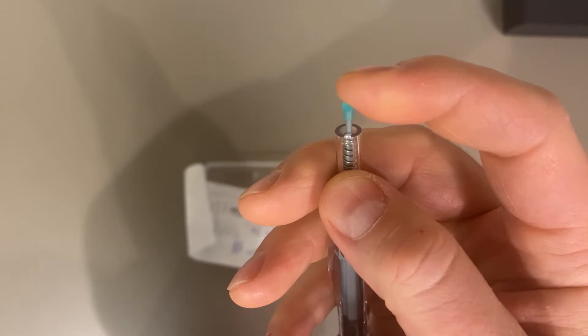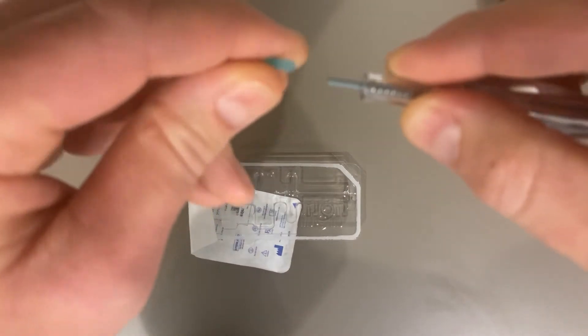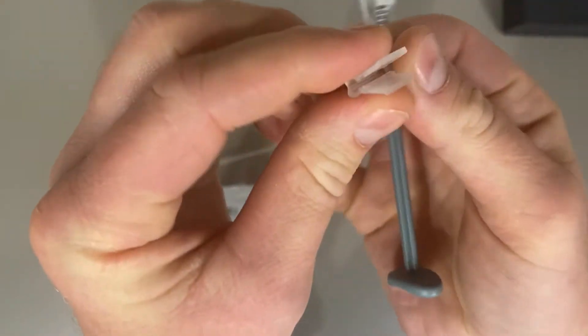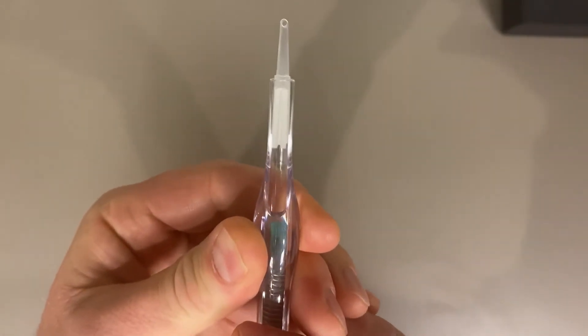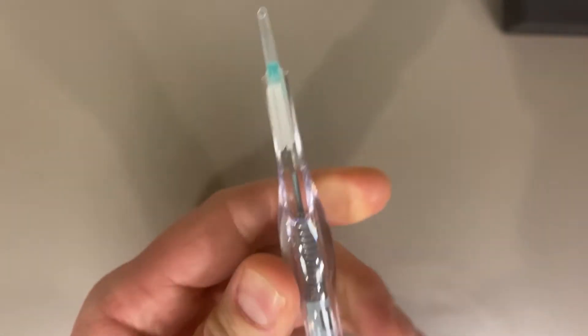There's a silicone plunger that engages with the cartridge, very flexible and durable. It can be easily removed and replaced, and as I've used this injector that's come in handy — you can reuse it if the IOL is not injecting properly, it can be reloaded. The cartridge itself has little wings that snap together and then are inserted into the injector where the plunger is advanced, and once it engages the injector it becomes a closed system that hydraulically pushes the IOL into the eye without any direct contact to the IOL, or with low contact.